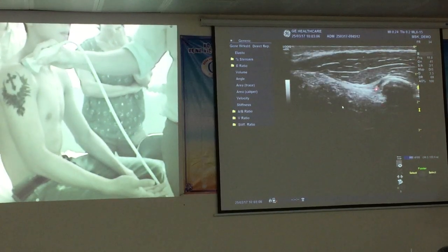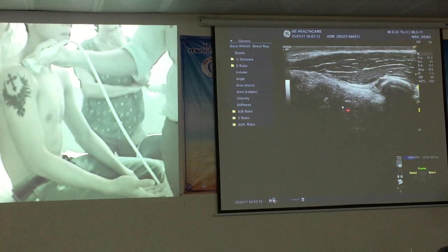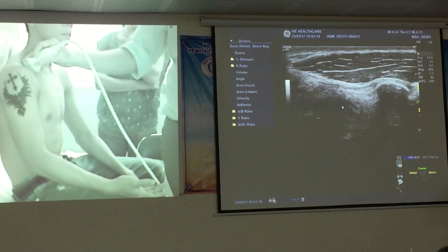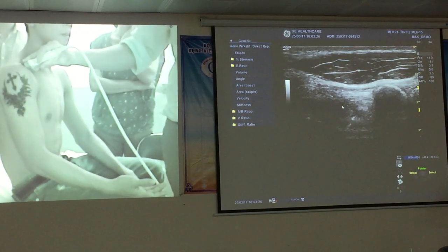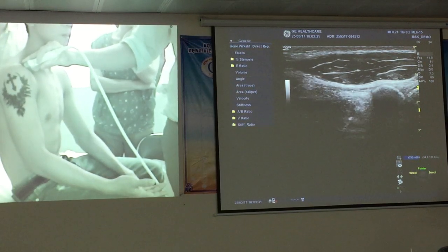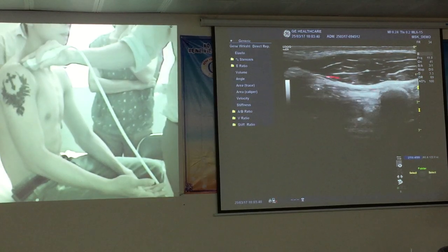Đôi khi chúng ta thấy cái dây chằng quạ cùng này nó không có thẳng căng như thế này mà nó sẽ bị phồng lên, thì phải cẩn trọng là ở phía dưới này có một cái chỗ nào đó như là tụ dịch, viêm gì đó, hoặc là một chèn ép nó đẩy cái dây chằng lên. So if we go up just a little bit and then rotate the probe counterclockwise, sau đó chúng ta xoay cái đầu dò. We can see from the coracoid process, this here is the proximal part of the coracohumeral ligament. Mình xoay đầu dò đặt vào cái vùng ngay cái chỗ mỏm quạ và xoay cái hướng ngang để khảo sát cái dây chằng quạ cánh tay.